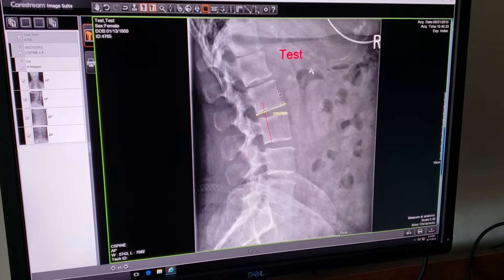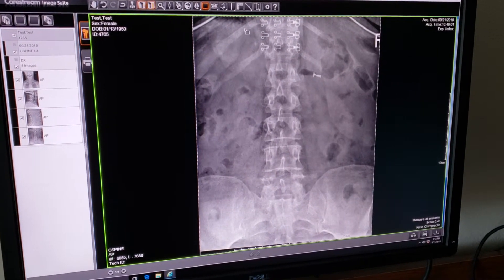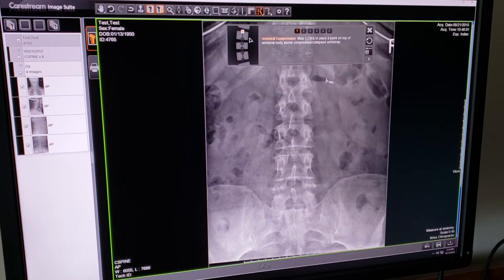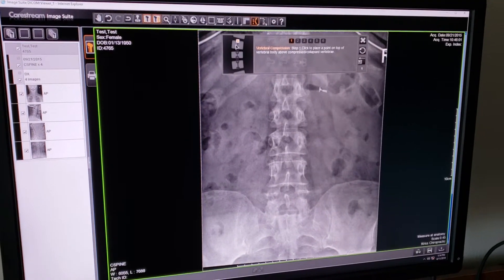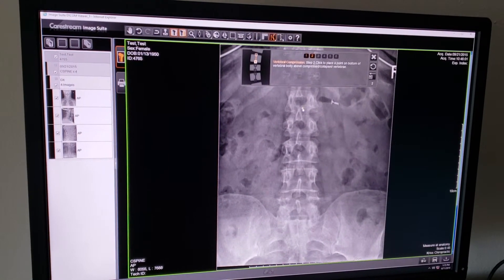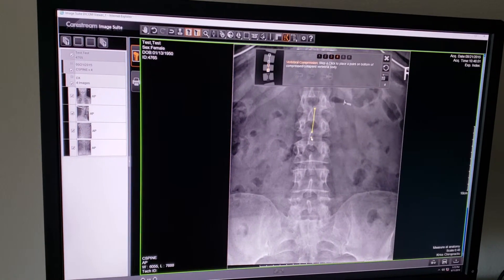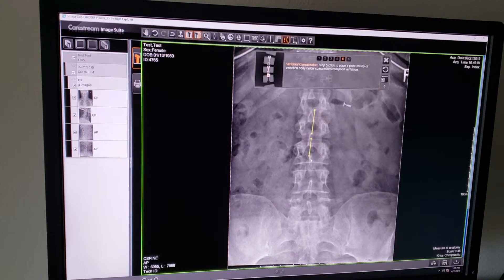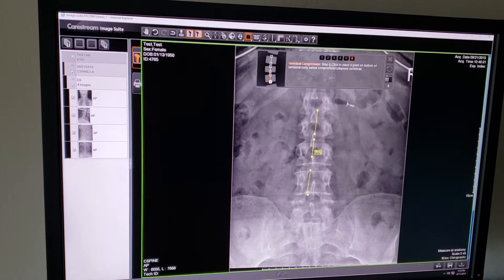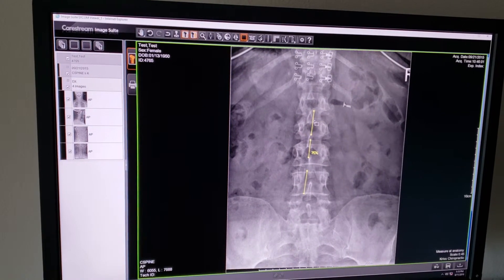The next tool is compression. Compression will measure a percentage of compression for a compressed vertebra. In the toolbar icon, the middle vertebra is actually compressed compared to the ones above and below. Place a dot top and bottom of the vertebra above the compression, then top and bottom of the compressed vertebra, then top and bottom of the normal vertebra below. It is telling us this line in the center is 75% of the average of the two normals.